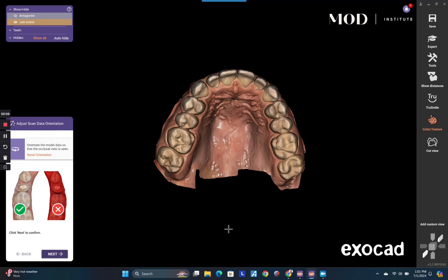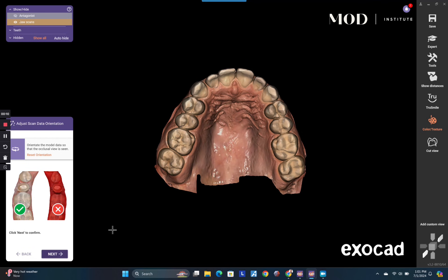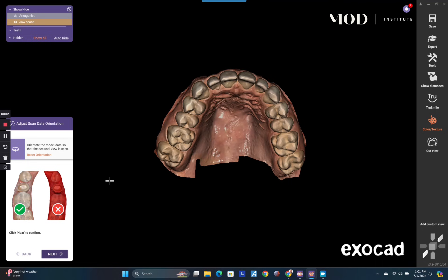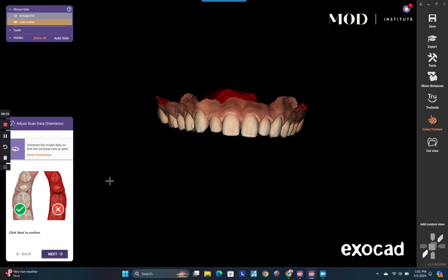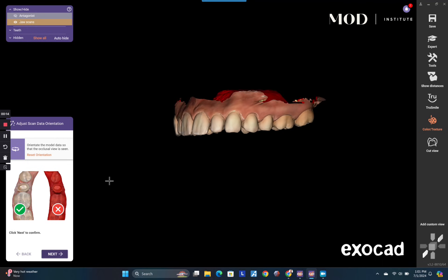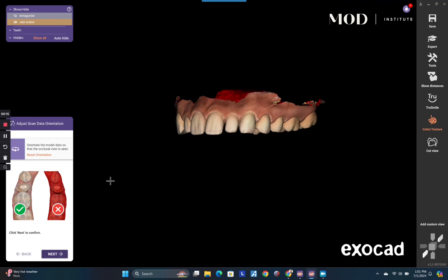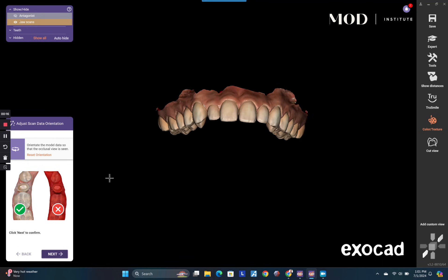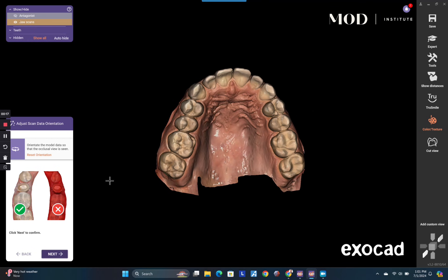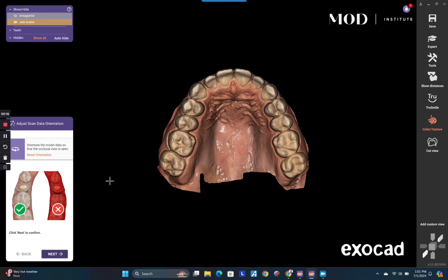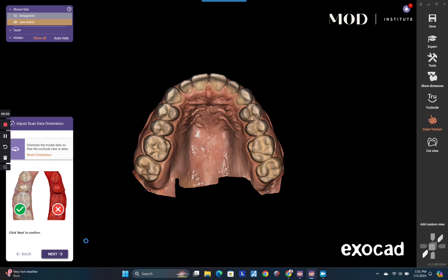Here we are at the model orientation stage. I'm just going to look right down at the incisal edges of the patient's model from an intraoral scan and rotate that model orientation just about like that, then hit next.